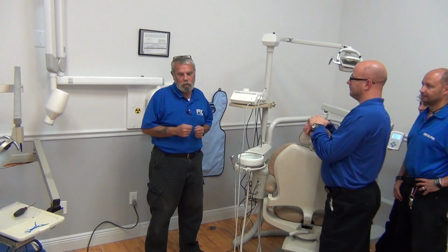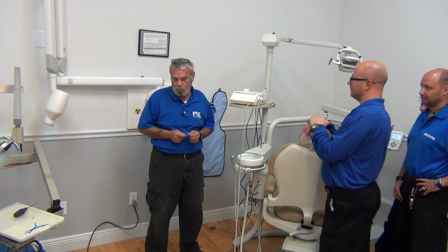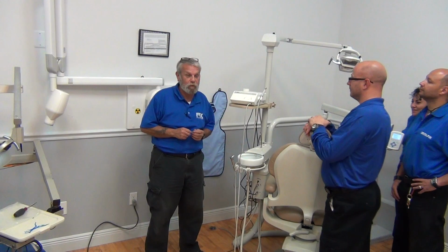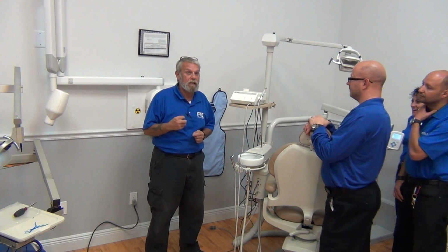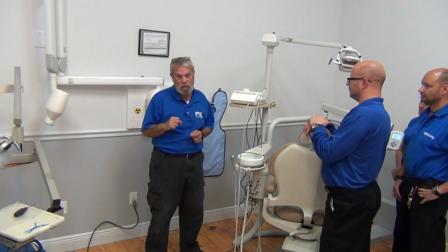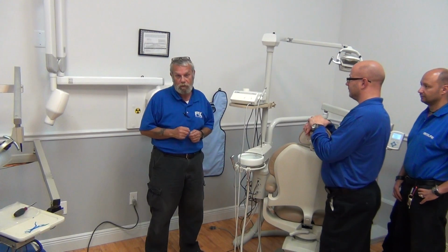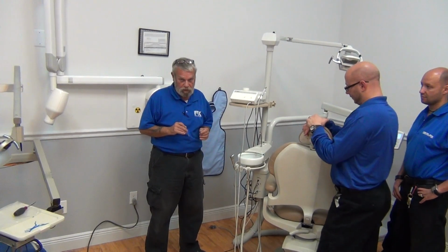Okay, we're going to talk a little bit about on-the-spot troubleshooting of a Prophy jet unit today. As you know, Prophy jet is not a Cavatron. You've heard the term Cavatron jet. That's a combination of Cavatron and Prophy jet. We're going to be dealing solely with Prophy jets today. They use a baking soda type powder mixed with water and air pressure to gently abrade and clean your teeth and remove stains.